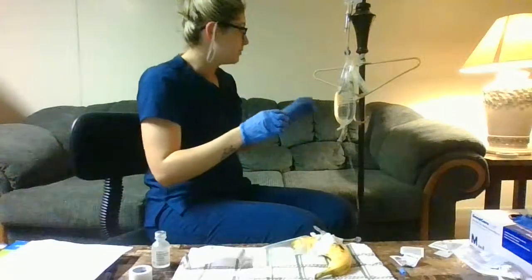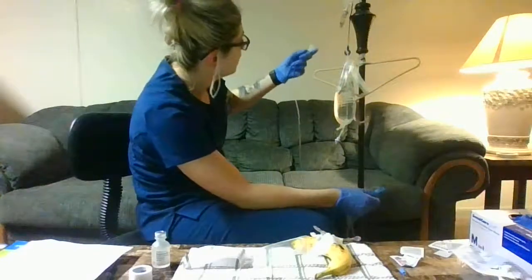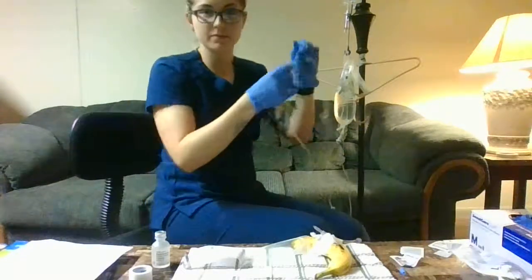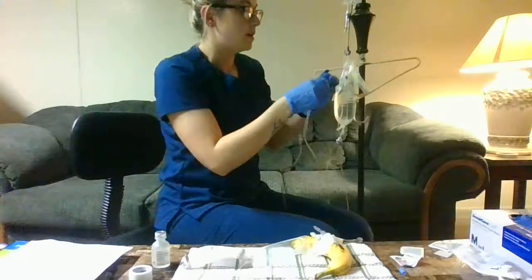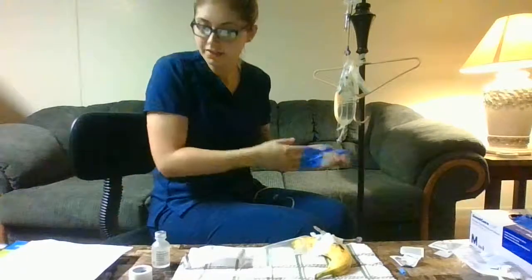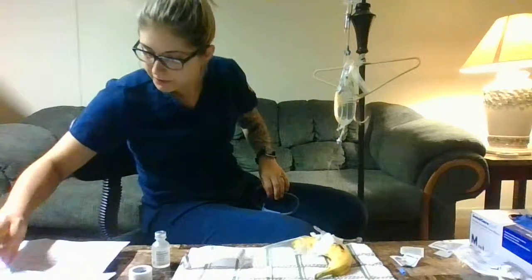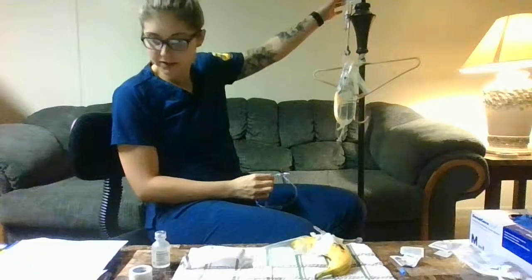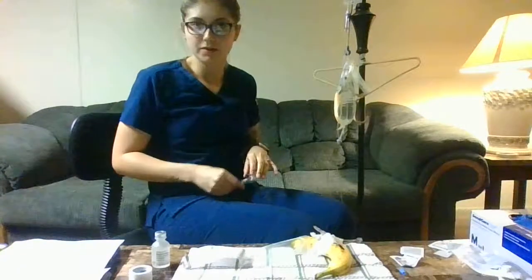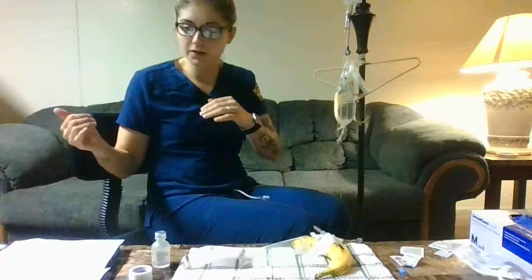And then we're going to unclamp this here, and we're going to use this main one to set the drop rate. So to set the drop rate for that, we have to do some math. So if you have 50 milliliters of the 0.9 saline to infuse over 45 minutes, so that's 50 milliliters over 45 minutes equals X over 60 minutes.